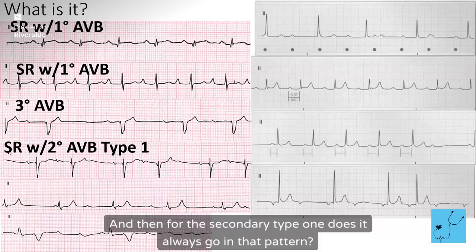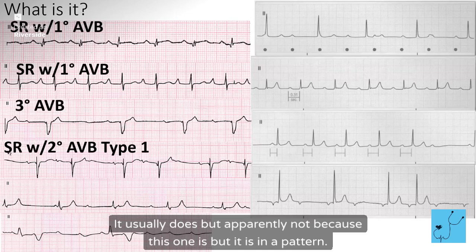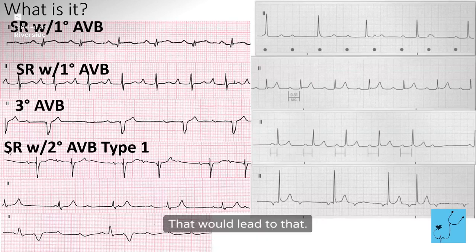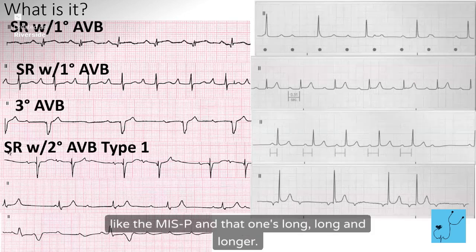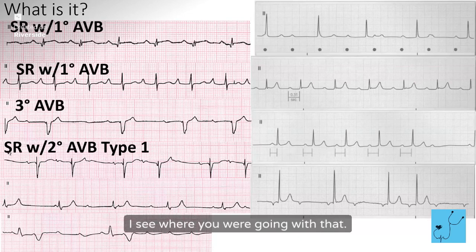And then for the second degree type 1, does it always go in that pattern? It has to be 3 longer and then it drops? It usually does, but apparently not here, but it is in a pattern. Definitely the PRs are getting longer like that. That's why I thought that, because this one's longer than this one, and that one's long and longer. No, that was a fair guess. I see where you were going with that. And then, what about this one?